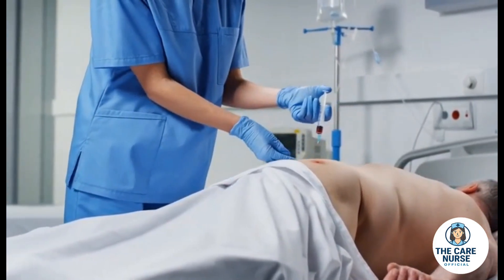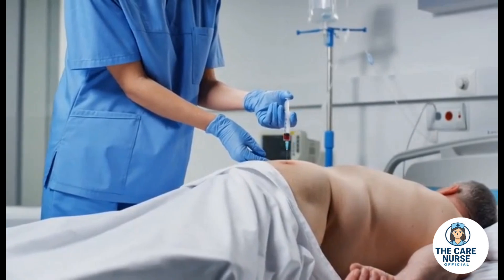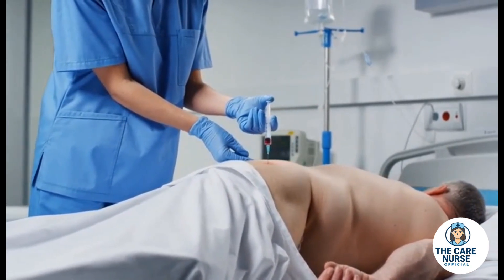Aspiration is shown briefly, checking for blood in the syringe before the medication is delivered, reinforcing the importance of safety in practice.